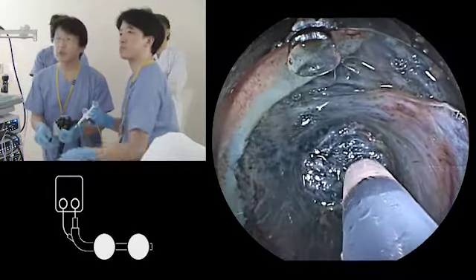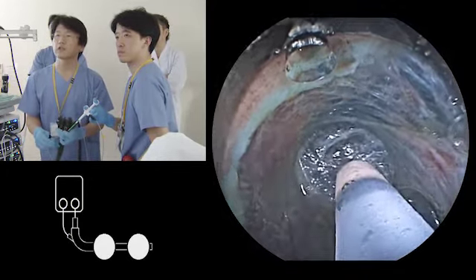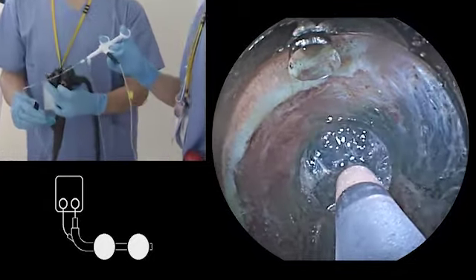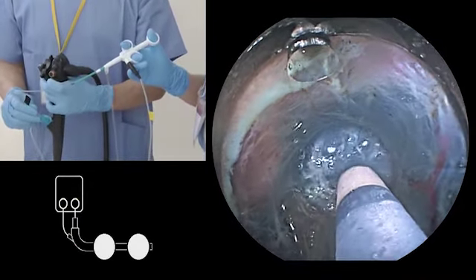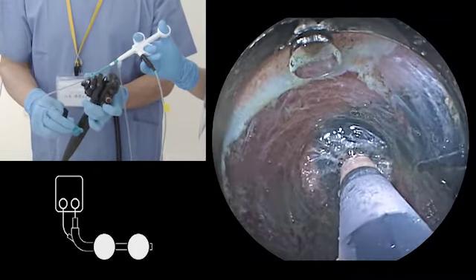Okay, I can show you how to do it. In order to do that, you have to have a good orientation in terms of the muscle structure. So this is on the fold. So go around the muscle fold, and then you can dissect.